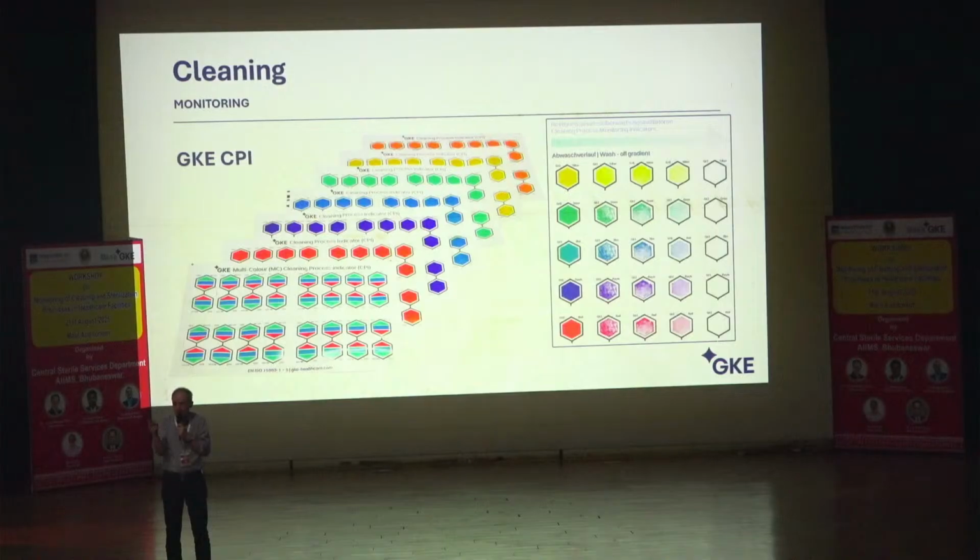We are in front of you, and we have in front of us 10 or 12 or 15 different procedures. All of these methods lead to clean instruments. This is okay. But the way to go there is completely different. And because of these different ways, we need different indicators.